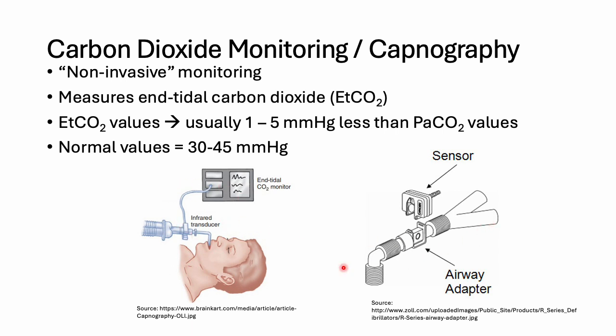Okay, so these are some different types of end-tidal CO2 monitoring devices. Most mechanical ventilators now provide that function of CO2 analysis. If that is not available, most ICU monitors will also have that function. Okay, so if the mechanical ventilator itself doesn't have that function, then that CO2 monitoring or capnography monitoring function is done through the ICU room monitors.